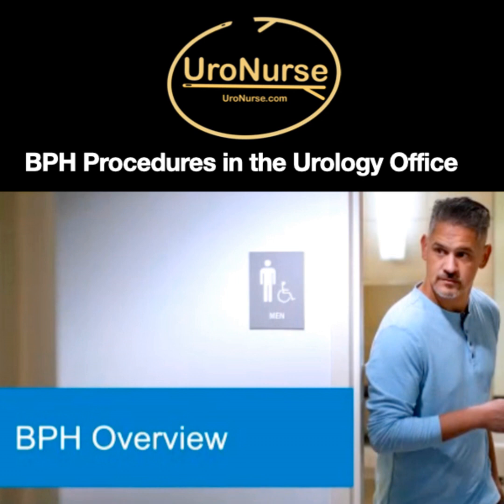Here's the reason I really like the Rezum. It's very durable. And this is 4-year data, and I should have mentioned that on the prior slide as well. The 4-year data is now 5-year data that they've published through the same study. And basically, the retreatment rates are really good. You're talking about a 4 or 5% surgical retreatment rate, and perhaps an additional 5% medication retreatment rate.